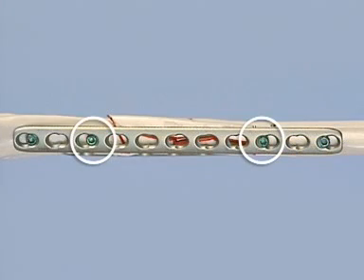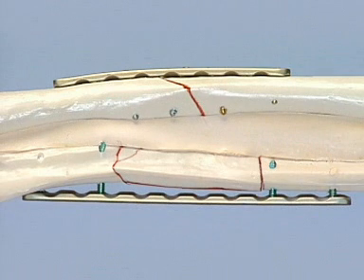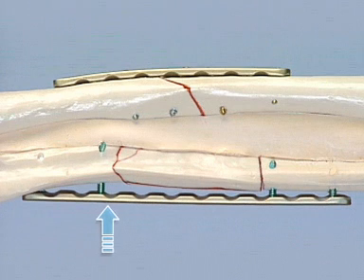Two more bicortical locking head screws are inserted close to the fracture area in the same manner as before. With two screws in each fragment and one hole left empty between the two, adequate stability to bridge the complex fracture is obtained. This exercise has illustrated how the LCP can be applied in two different ways: first, as a conventional compression plate for the simple fracture of the radius, and then as a purely internal fixator to bridge the complex fracture of the ulna.